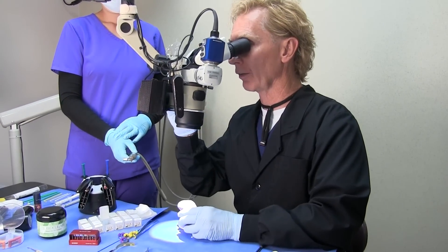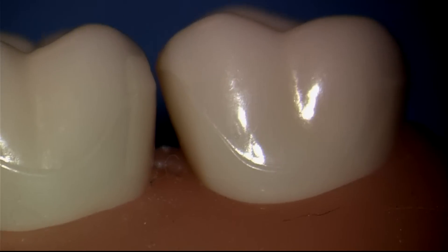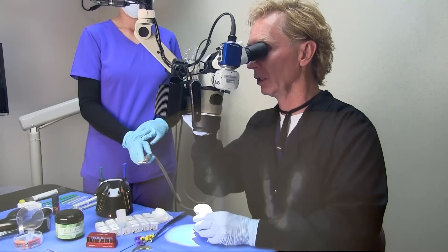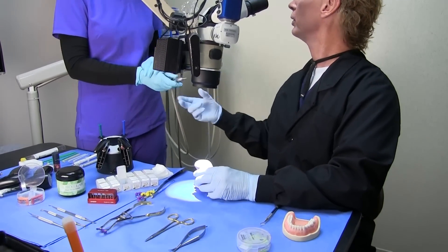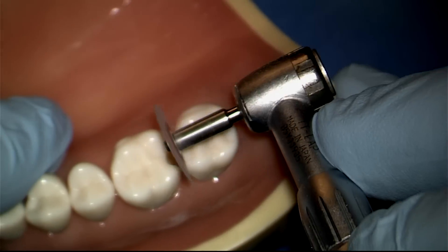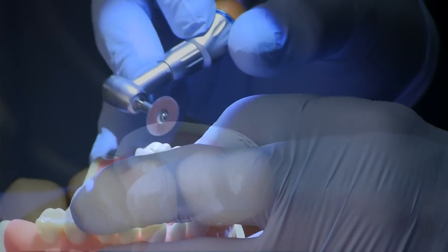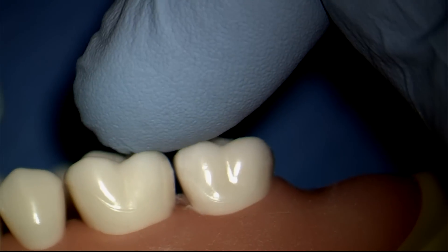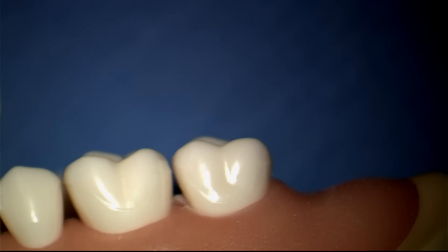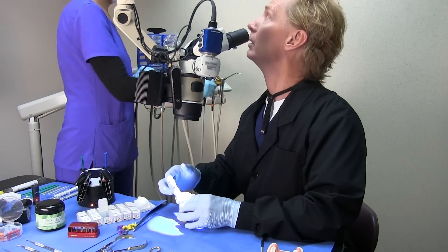The first thing we want to keep in mind is a lot of naturally occurring contacts are what we call a kissy contact. You'll notice in this particular case — I'll put two different backgrounds here — that the contact is really too high on the occlusal. A lot of contacts are naturally not very smooth, so what we like to do is take a disc and flatten and smooth the neighboring tooth. We have now flattened the contact, there's a much larger contact, it's no longer invading the space of the neighboring tooth, which often happens when we have a little bit of crowding. That contact is now going to be much better and much more in the middle of the tooth.